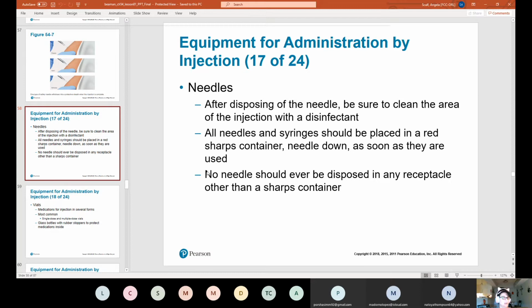You have the needle, you can hand them the patient. I always interact with my patients when possible. Have them place the gauze, bend their arm, and then before I do anything, I dispose of my needle. There are a lot of people that set their needle down on the tray, or that'll cap it or this or that. I don't do that.